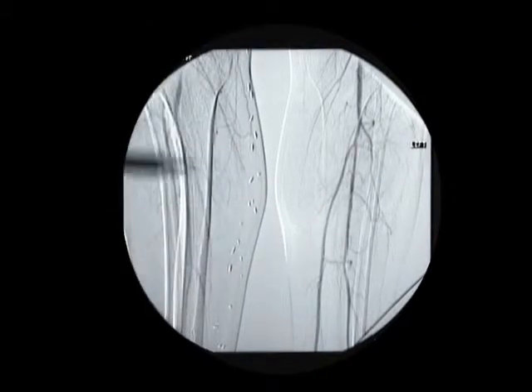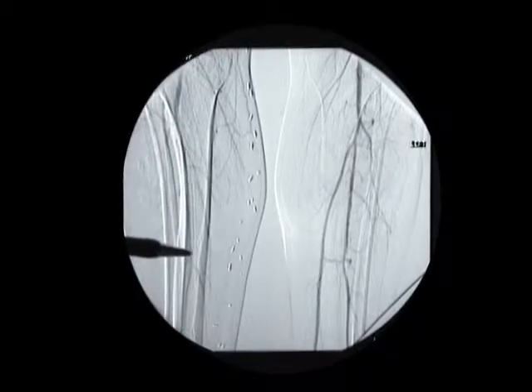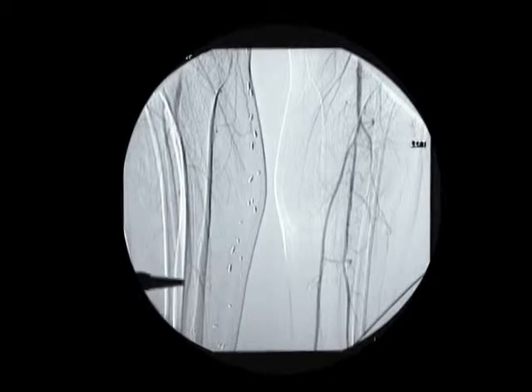However, the right leg shows no reconstitution of named vessels. The vessel that was seen in the initial image is actually just a small branch and not a named vessel. With no named tibial vessels in the runoff, and especially with prior vein harvest, this right leg is in fact appropriate from an anatomic standpoint for inclusion in the trial.